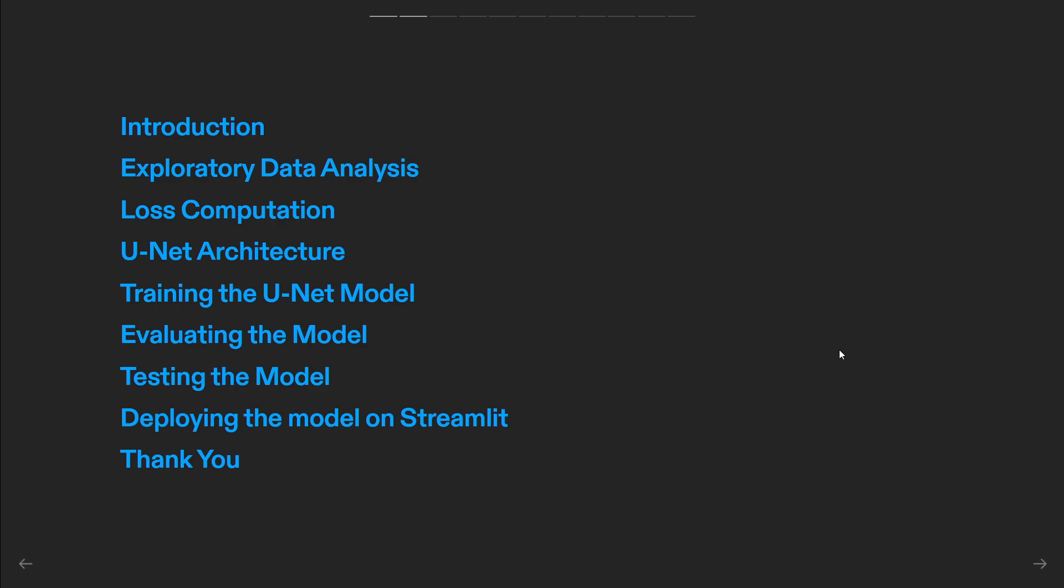Let's briefly outline the topics we'll cover in this tutorial to give you an idea of what to expect. We'll start by understanding the dataset and its characteristics, which are vital for successful segmentation. We'll explore different brain regions labeled within the dataset and discuss strategies for data preprocessing, quality control, and cleaning. Next, we'll delve into the U-Net architecture as well as the loss computation, a powerful framework specifically designed for medical image segmentation.